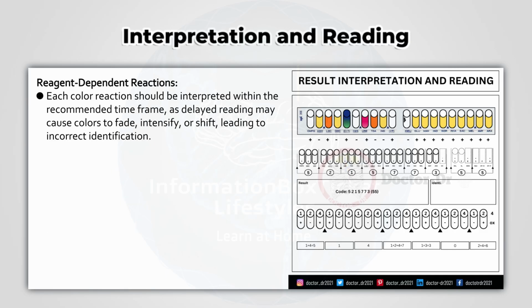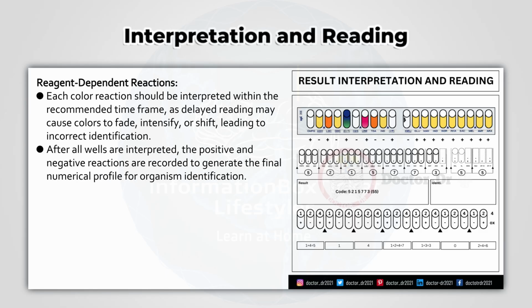Each color reaction should be interpreted within the recommended time frame, as delayed reading may cause colors to fade, intensify, or shift, leading to incorrect identification. After all wells are interpreted, the positive and negative reactions are recorded to generate the final numerical profile for organism identification.